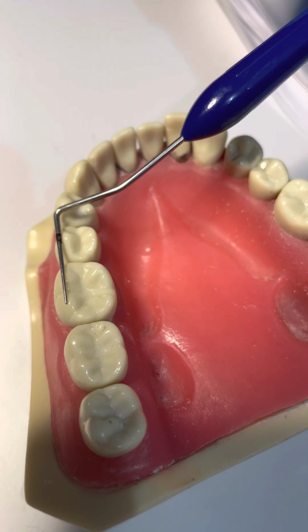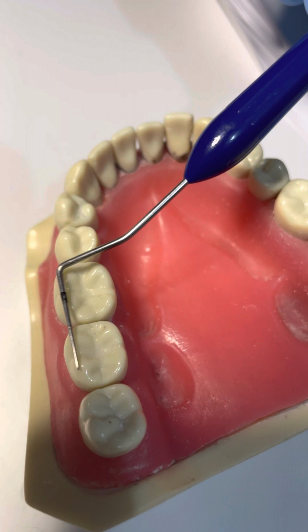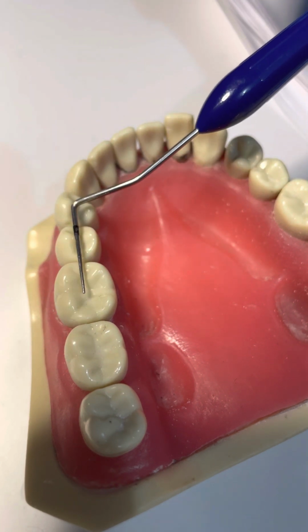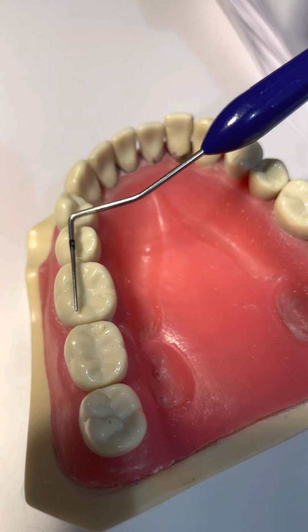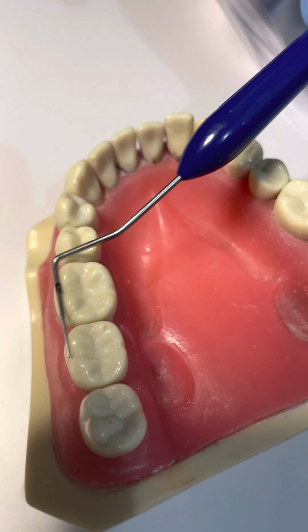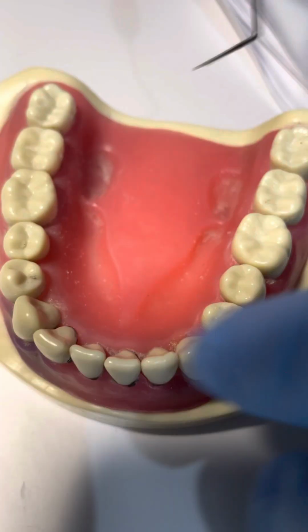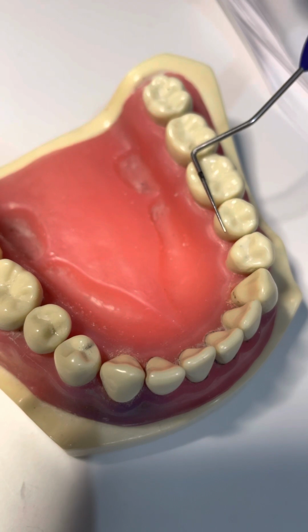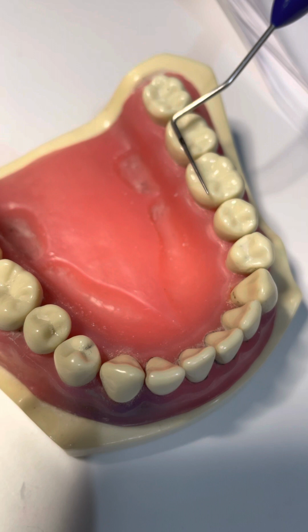So when you're checking, check with the premolar, and then again check with the molar. Both times the cuspal height has to be equal. You run your probe with the premolar, and then you run your probe with the second molar. Both times it has to be equal. This side also equal, and then this side it has to be equal.